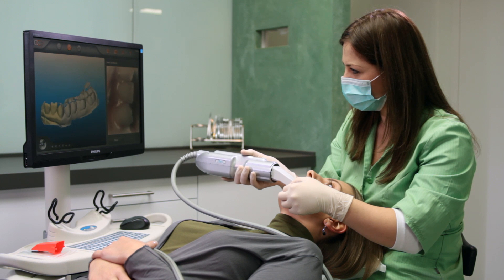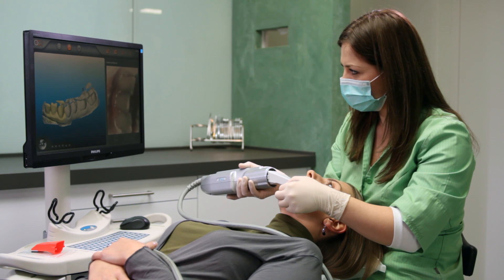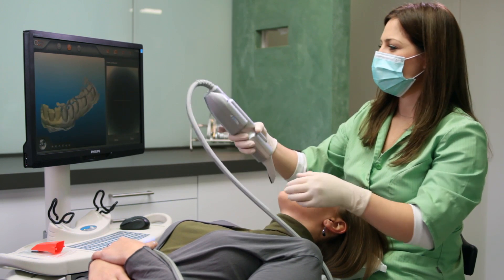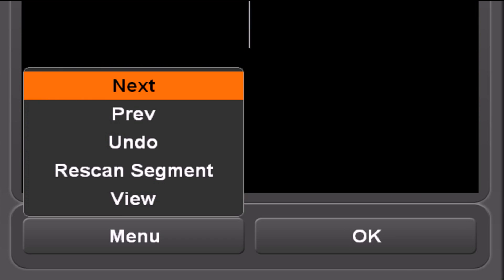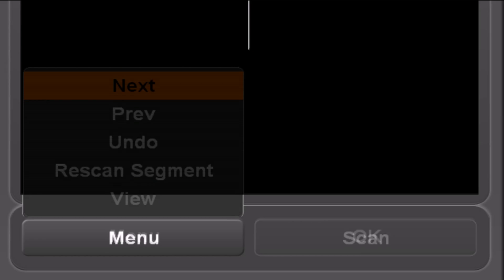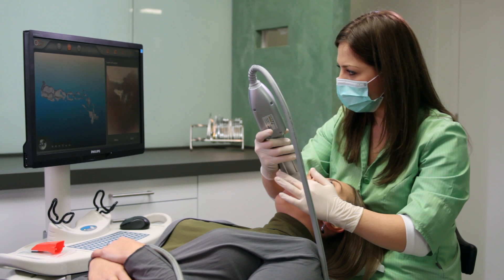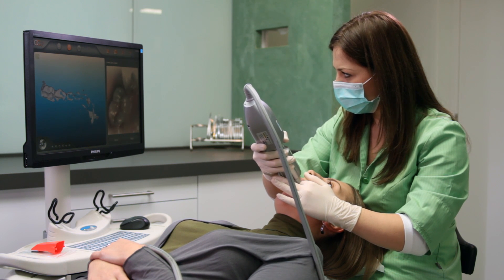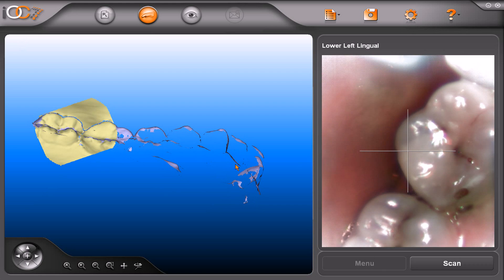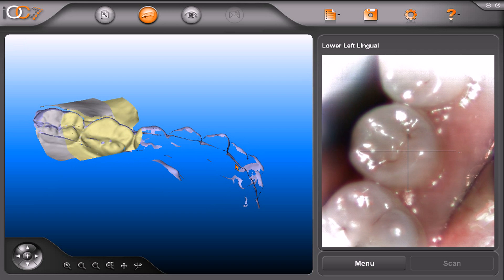As you approach the anterior, the scanner is going to turn with the shape of the arch in order to scan just beyond the midline. Continue by pressing the pink foot pedal, followed by pressing green to say next segment. The next segment is the lower left quadrant on the lingual side. Start with the most distal molar. As you move forward in the mouth, angle the scanner slightly, being sure to focus on the interproximal areas.